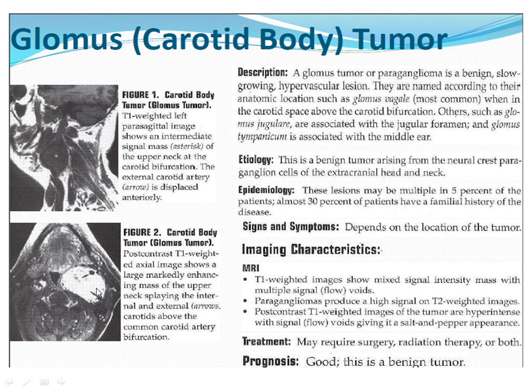If you think of the common carotid artery coming up to your brain, the internal carotid artery keeps going cranially and it's posterior, and the external goes a little bit anterior and starts supplying your face. So this tumor just sits right in the middle of those. That's why it's also called a carotid body tumor. And it's a type of paraganglioma. You can see paragangliomas in multiple locations in the body, so this is the specific name of it when it happens in that location.